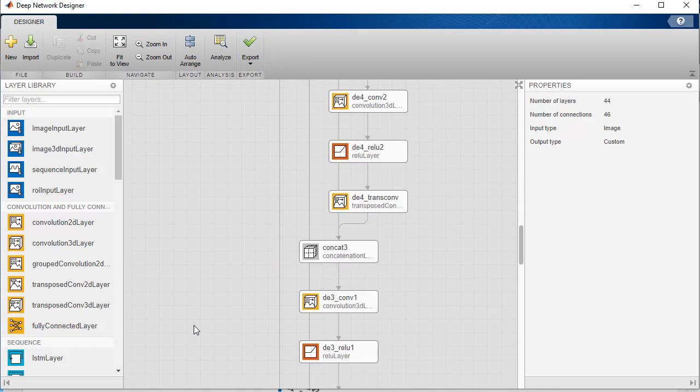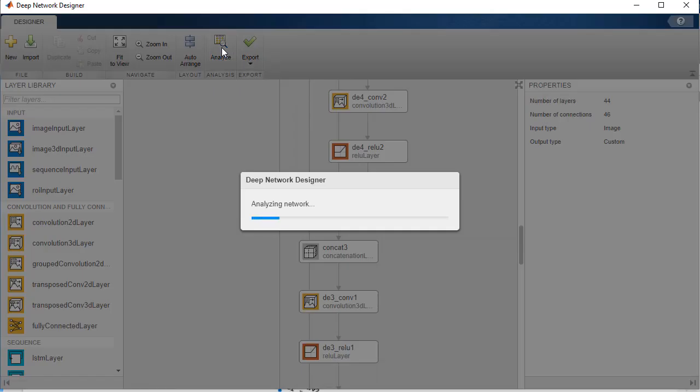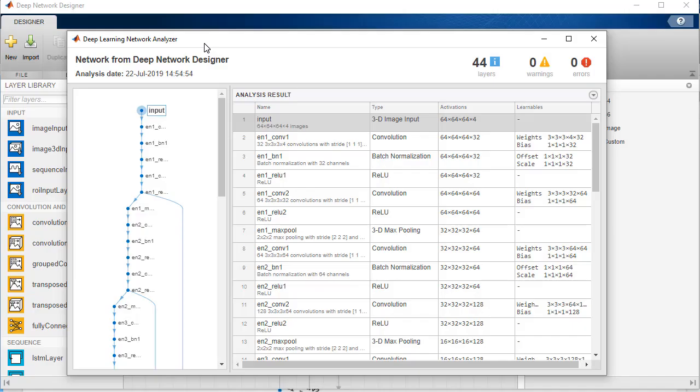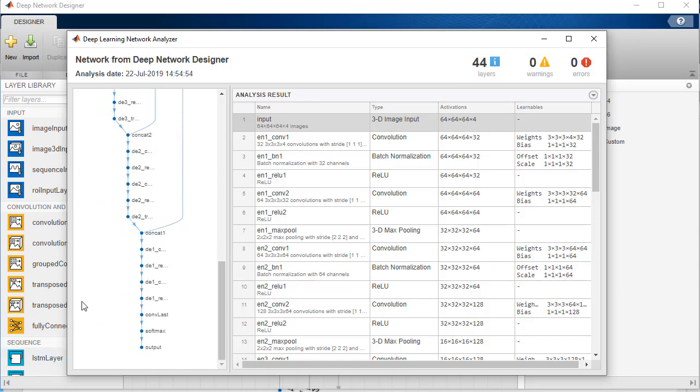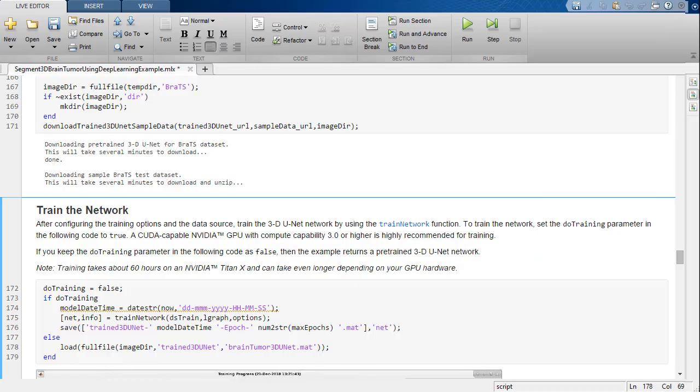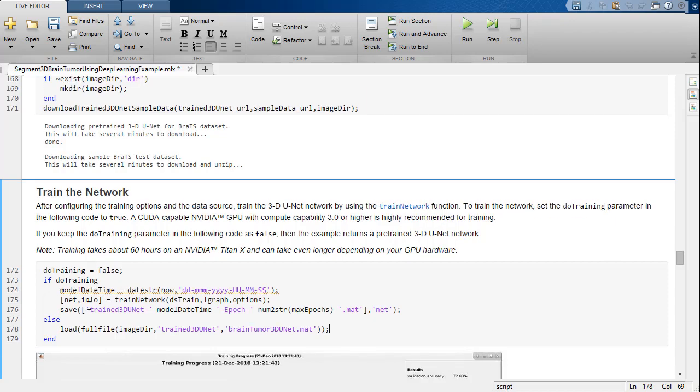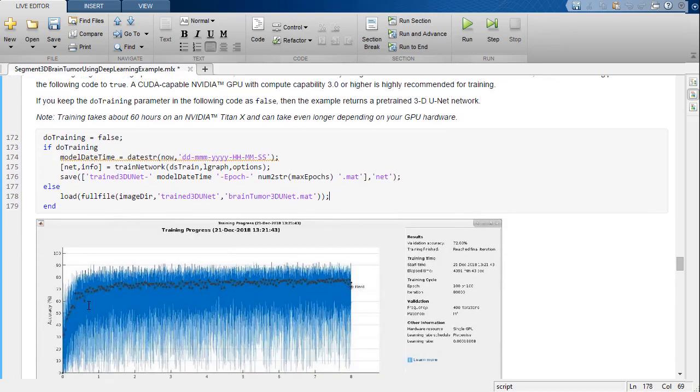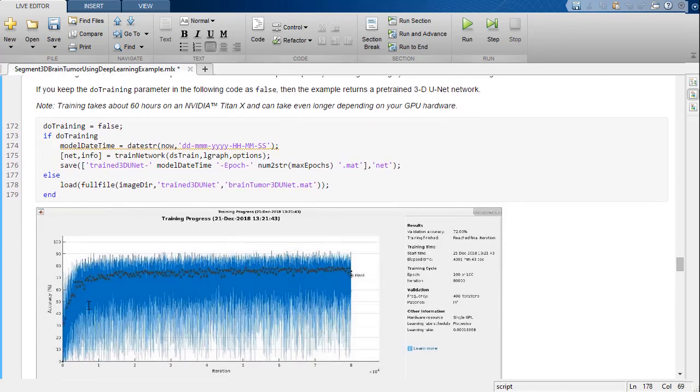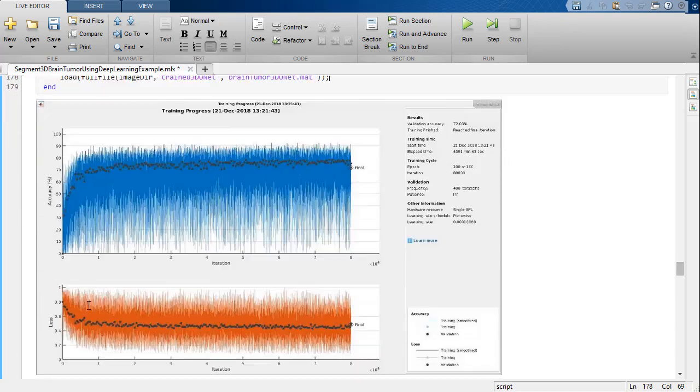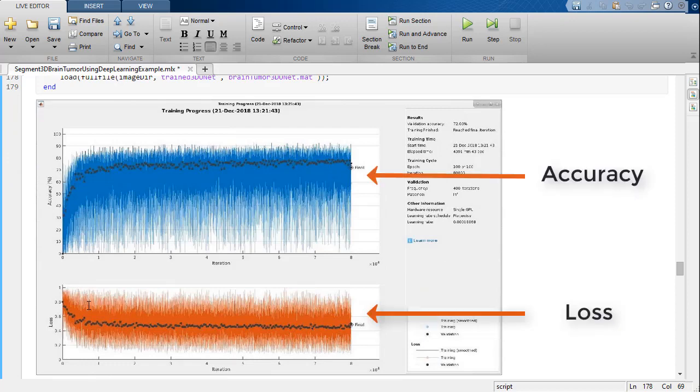The Deep Network Designer can also be used to design and visualize the network. We can also analyze the network to search for any errors. Training the network on the entire data set takes a long time, so for this video I'm going to load the pre-trained network. We can see the network accuracy and loss through the training results.